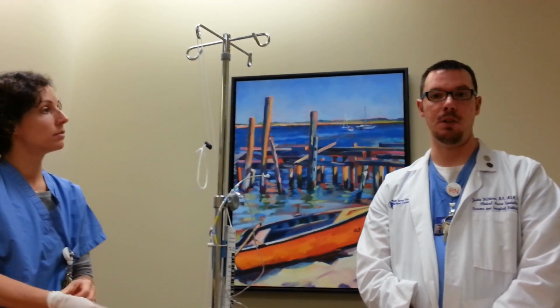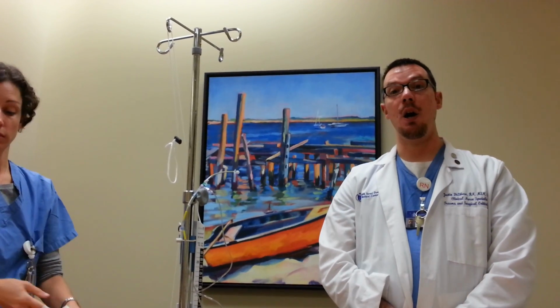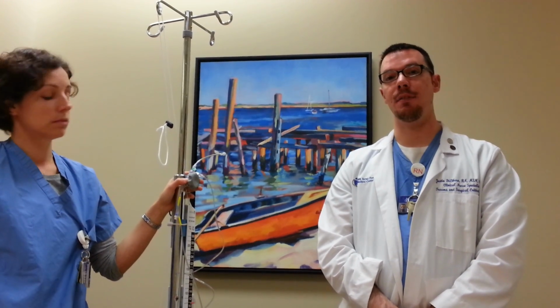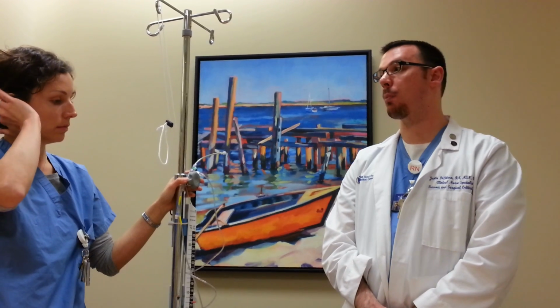So to think about how this relates to general patient management, in the OR, and when you're transporting from the OR to the ICU or transporting anywhere with these patients, we always have the catheter closed to drainage, but as Joanna mentioned, always open to monitoring.